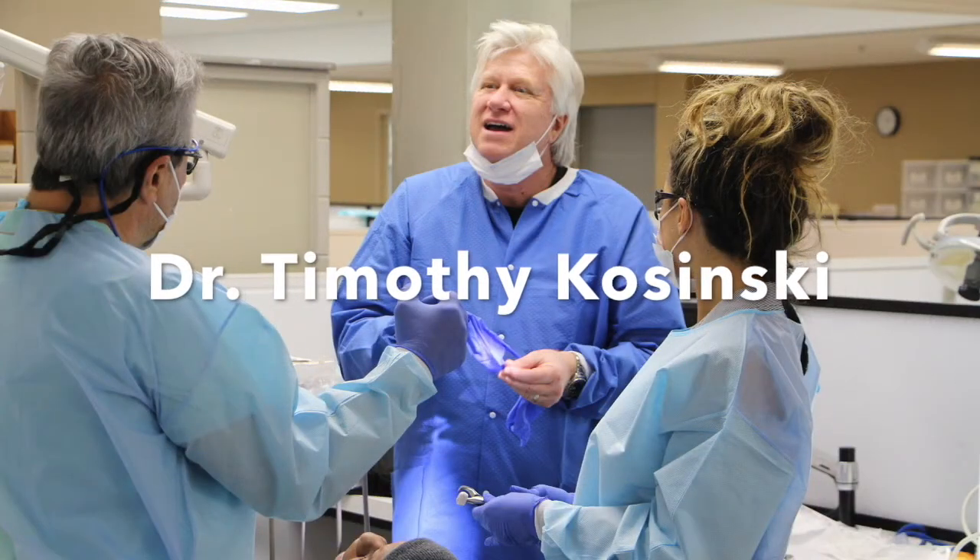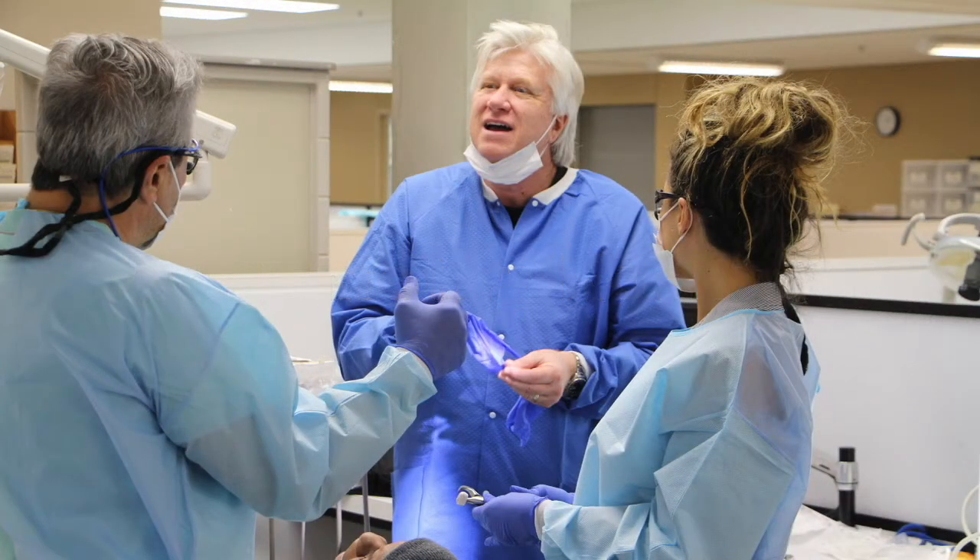Hi, I'm Dr. Tim Kosinski from Bingham Farms, Michigan, and today we're going to demonstrate the use of the GoldenDent Smart Dentin Grinder. This is going to be a very efficient way of grafting.